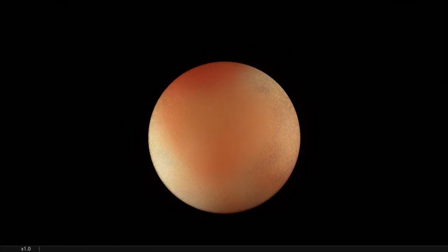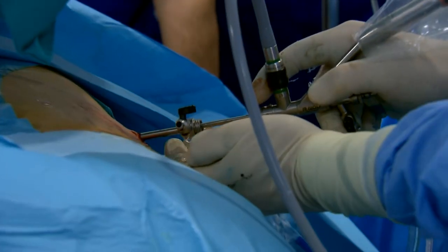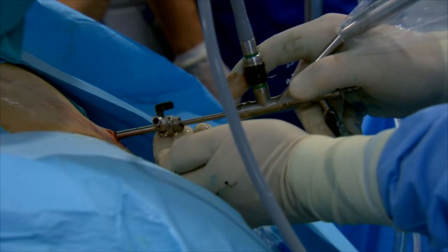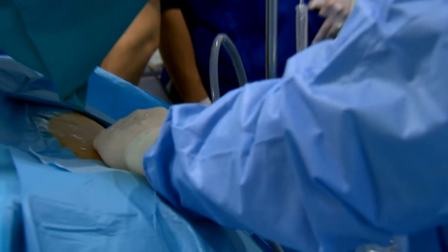Why am I doing this? Because we always need the maximum space to allow the small fragments to come out of the kidney. You can clearly see that the irrigation water is 100% clear. This is 100% clear if the Amplatz sheath is inside the calyceal system. Now let's look for our stones.